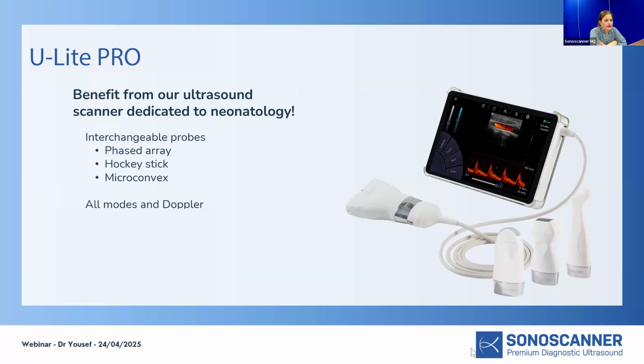We don't keep our probes sterile, but what we do is sanitize everything before, meaning the probe itself all the way down, the whole thing, and also the keyboard and the screen before and after each patient. And in my unit we have a checklist every day. It's taken when the nurse's aide cleans the whole thing.